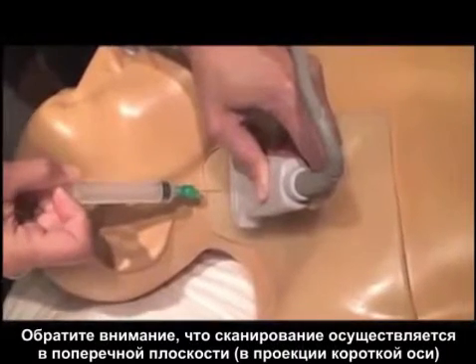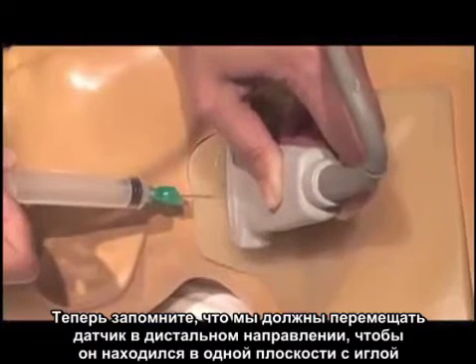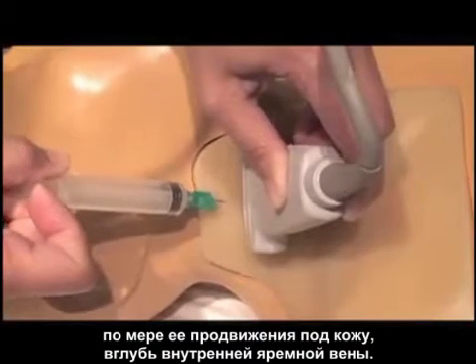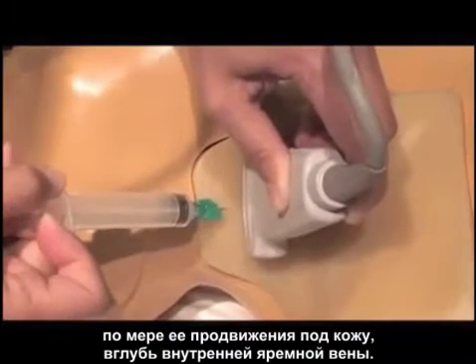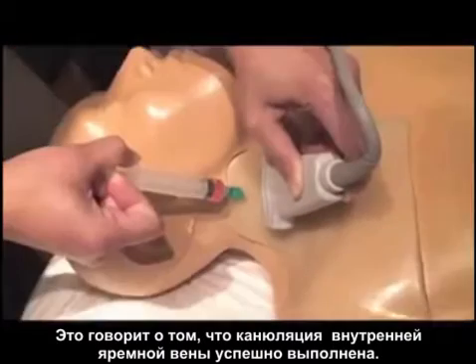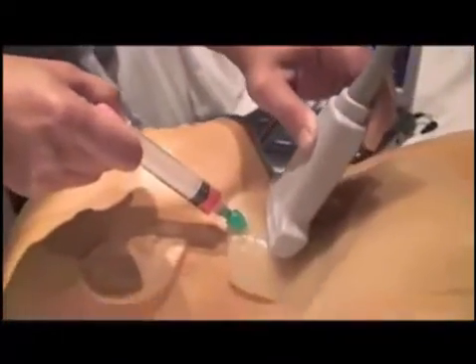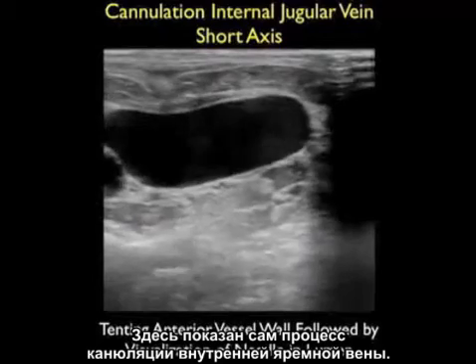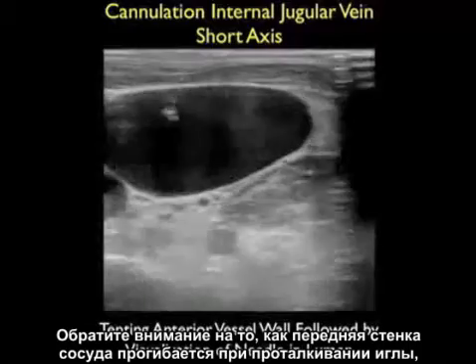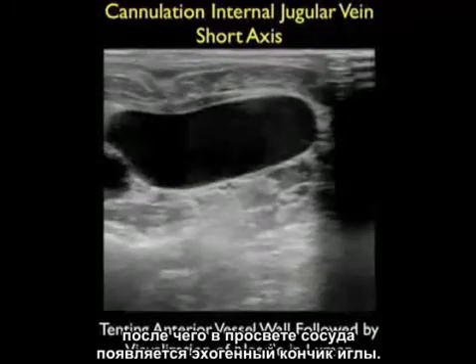Notice we have the probe in a side-to-side or short axis orientation and the needle coming in at a 45 degree angle underneath the probe. Remember that we must move the probe distally to stay in plane with the needle tip as we advance it underneath the skin and into the internal jugular vein. As we do that, we notice that we've successfully cannulated the internal jugular vein as shown by the red flow of blood. Here we see a side orientation of the needle with regard to the probe.